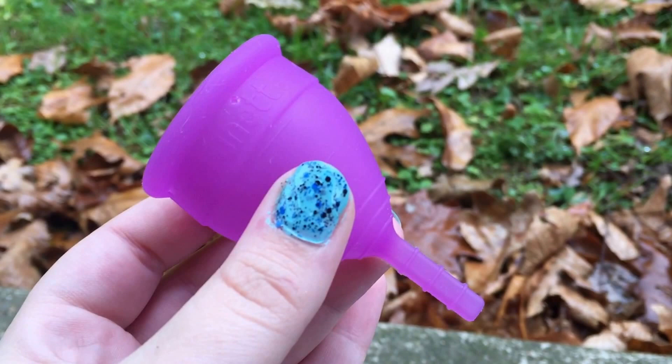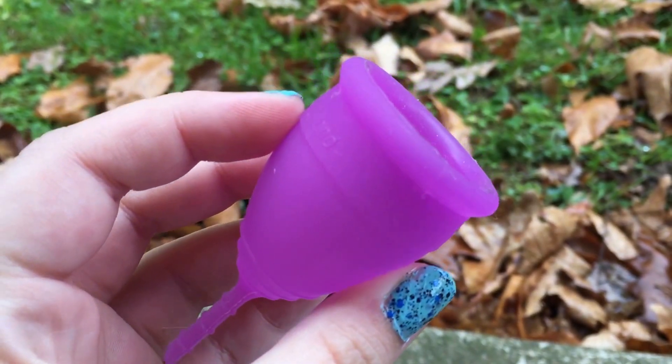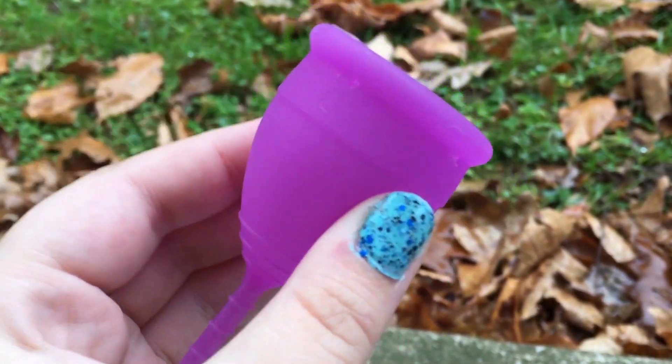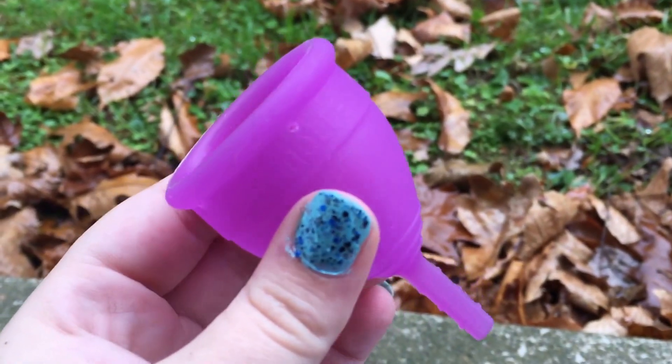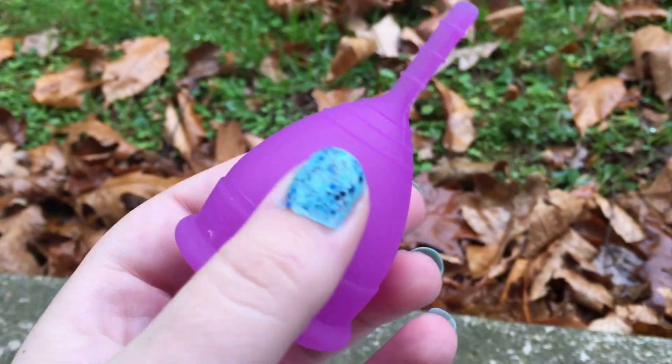I'm thinking that this may be one of my favorite cups — this may even be my most favorite. I've only done dry runs with this, but the way things are going I feel like it is probably going to be a favorite. I won't know until I test it out and get to do my reviews on all of my cups.